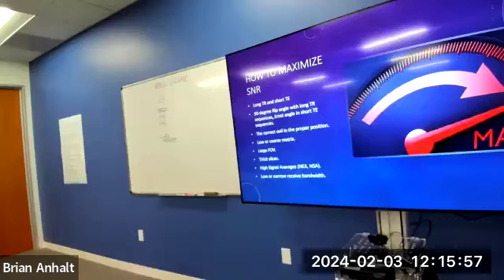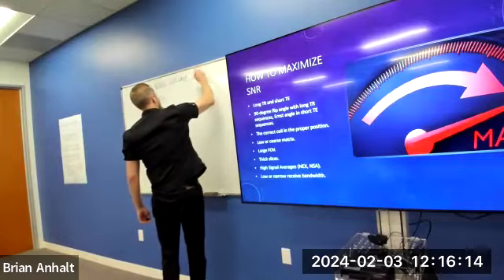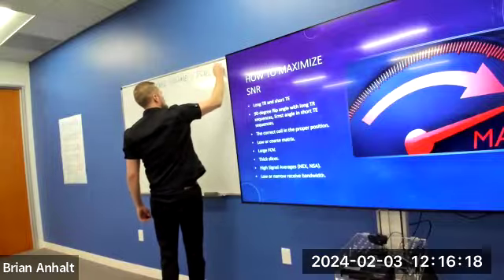We just multiply this side by this side, it gives us our area. If we want to know how much volume or how much three-dimensional space it takes up, we have to add that third dimension. So we multiply it by the depth and the thickness of the table, right? So be careful. The quiz is going to ask you to find pixel area or voxel volume or both. You need to know the difference.